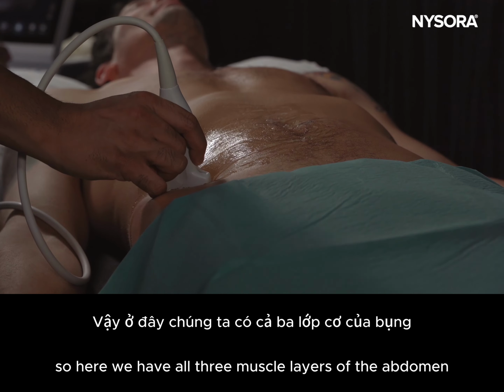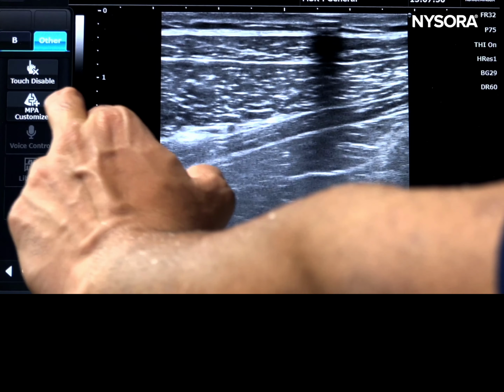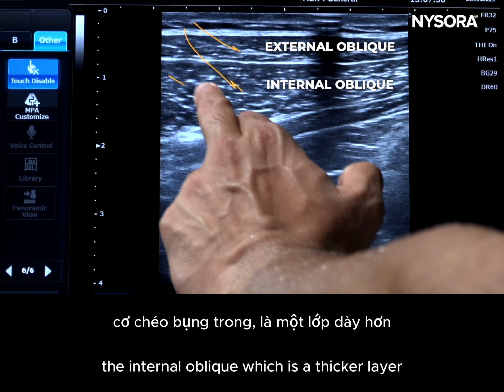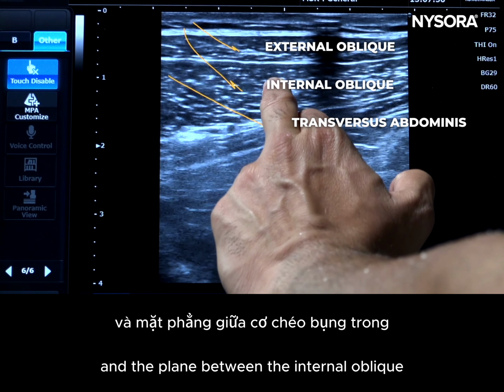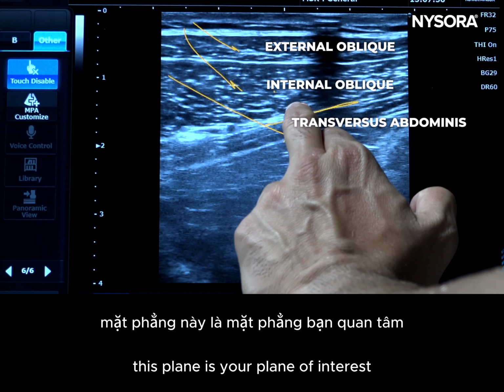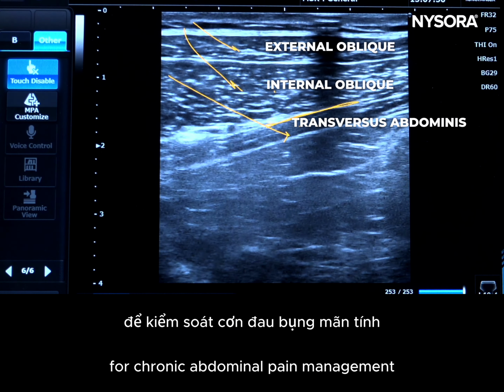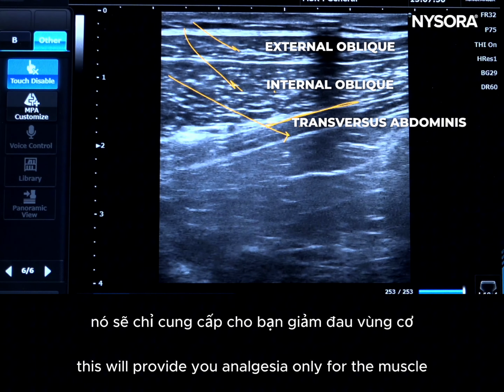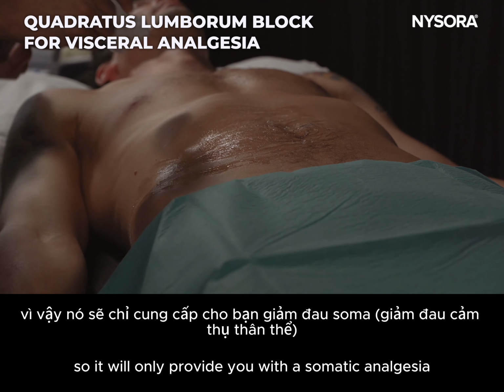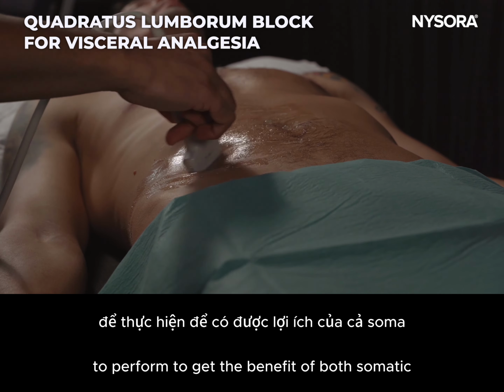So here we have all three muscle layers of the abdomen: the external oblique, the internal oblique, which is a thicker layer, and the transverse abdominis. And the plane between the internal oblique and the transverse abdominis is your plane of interest, where you would inject the local anesthetic and steroid mixture for chronic abdominal pain management. This will provide you analgesia only for the muscle and the muscle plane. So it will only provide you with somatic analgesia.